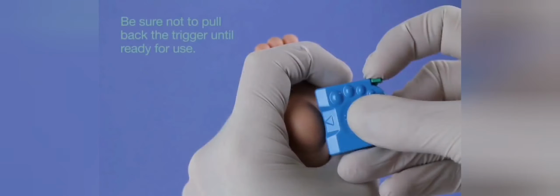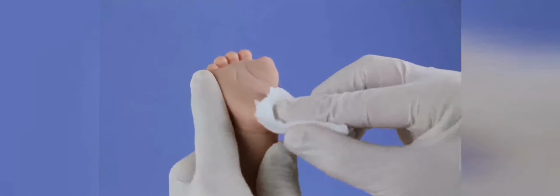Use a gentle pressure to make a rounded drop of blood. Do not use excessive pressure at the punctured site. Be sure to dispose of the lancet in the appropriate container and dispose of the contaminated materials in appropriate waste receptacles. Wipe away the first drop of blood using clean gauze. Make sure to wash your hands again.